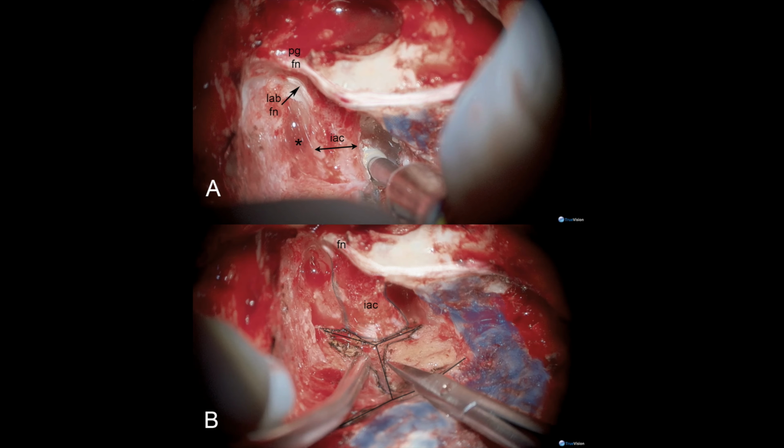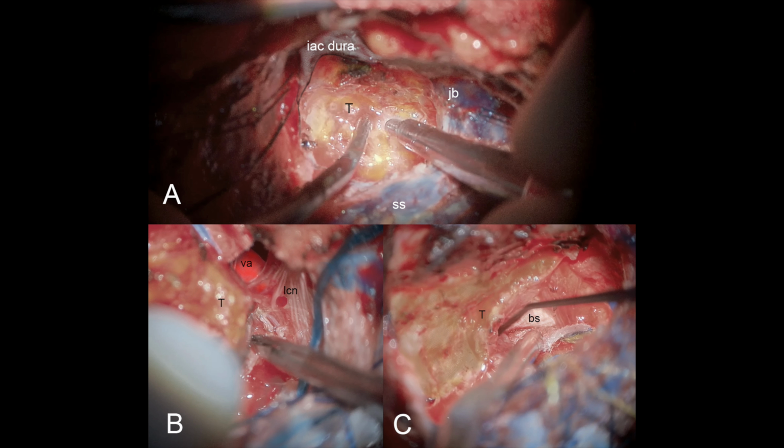The fat graft has been removed and the internal auditory canal, labeled IAC, has been fully delineated, along with the labyrinthine segment of the facial nerve, labeled LFN. When the exposure is complete, the posterior fossa dura is opened using an H-shaped incision, and the superior and inferior flaps are gently tacked laterally for a clean, stable field. The tumor is then centrally debulked.